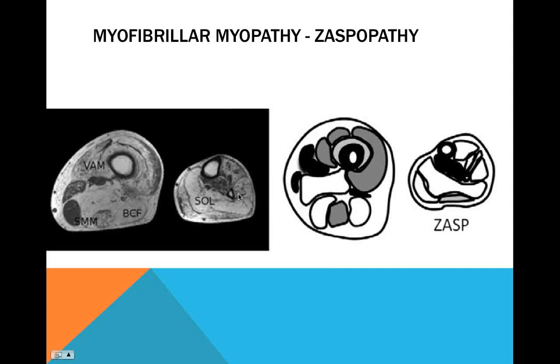Yeah, I mean, nothing has been clearly described in the literature yet, so you could potentially get the MRI, but then interpreting it will be difficult. I would say if a kiddo is being sedated for something else and they're already in the machine, you know, why not just add a few extra sequences? Go ahead and do it.